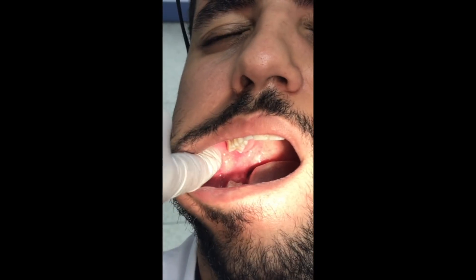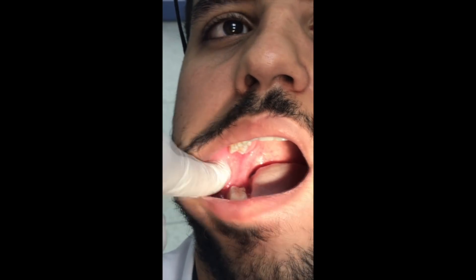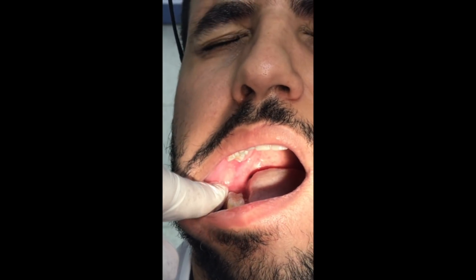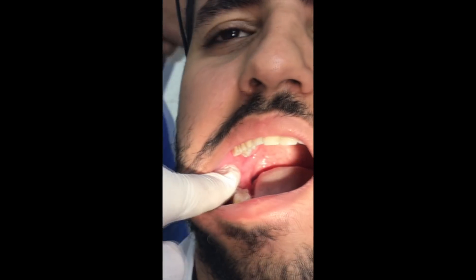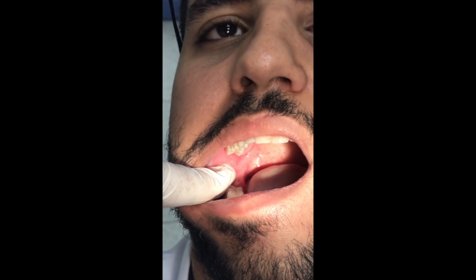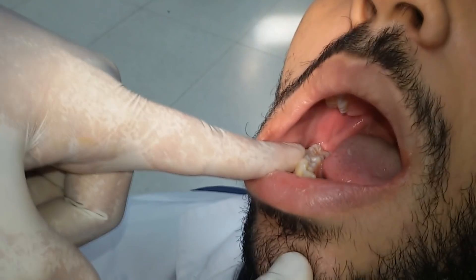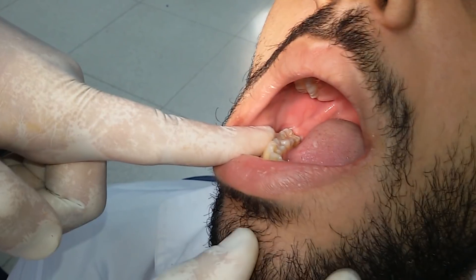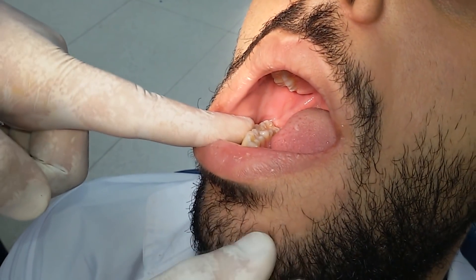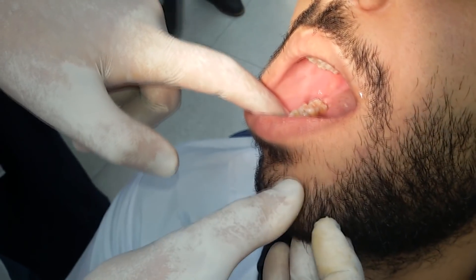Another mistake: if you don't place your finger so that the fingernail faces upwards and parallel to the occlusal plane, and try to trace the external oblique ridge, you may find it difficult and may easily lose the landmarks. Another mistake is when you proceed for the injection while the patient is not tilting their head towards the practitioner. You have to gently tilt the patient's head to face you.